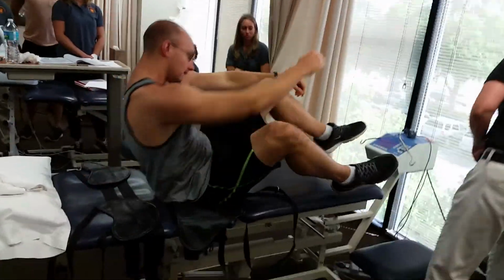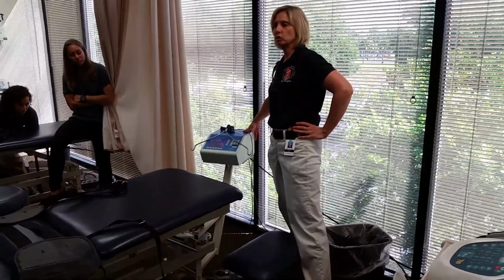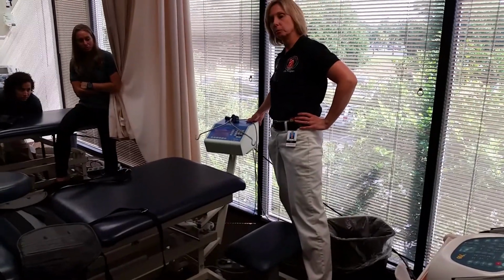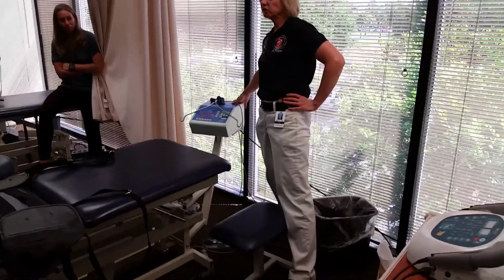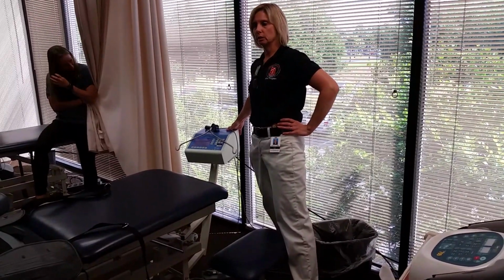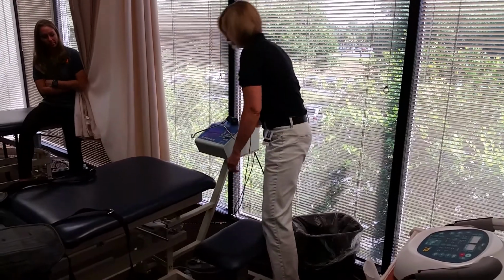The other thing you can do with this unit, which is kind of nice for cervical traction, is that you can create a side bend for traction. So if you're trying to emphasize one side of the neck, if they have radiculopathy, and you find with manual traction they do well with side bending, you can add a side bend to it. I guess theoretically you could do this with pelvic traction also. Create a side bend in the prone position. Kind of open up one area. Never done, personally have not done it, but.